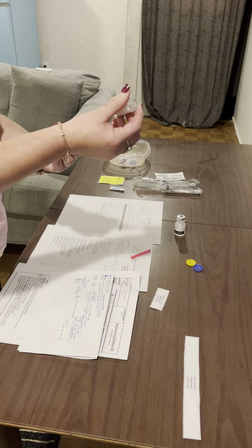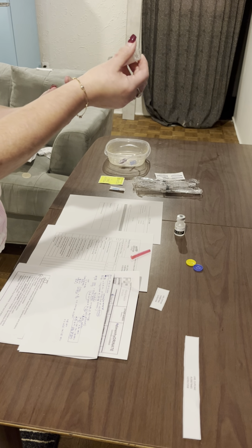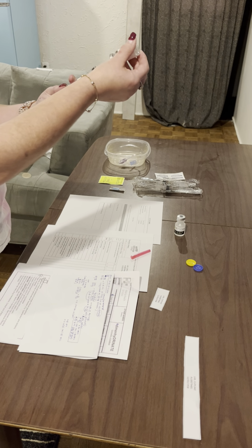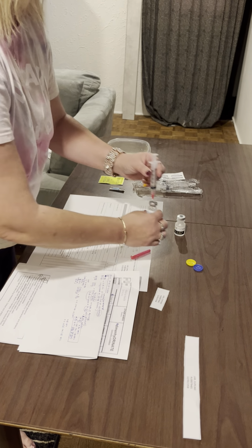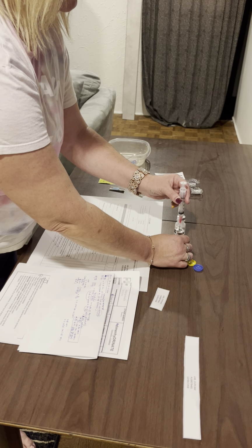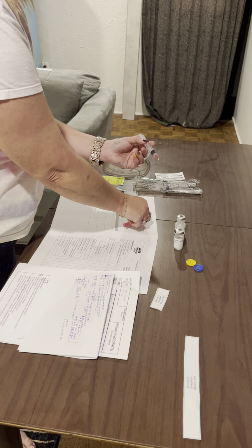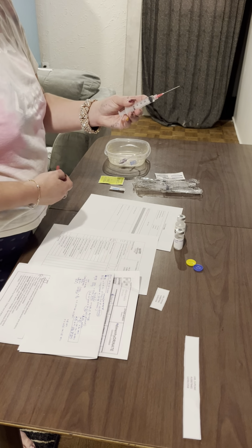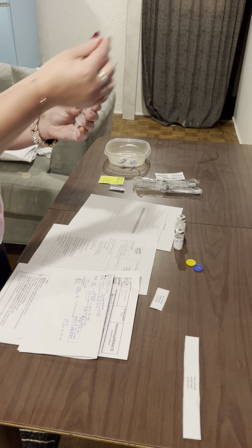Now, while we've been talking here, this might have moved a little bit. So I'm just going to pull down to make sure that we have 0.5. And again, we have 0.5. Okay. So I am going to take this out now, very slowly. I am going to ensure that this is at 0.5 again. Just making sure 2, 4, and the middle of the plunger is. We're going to recap.